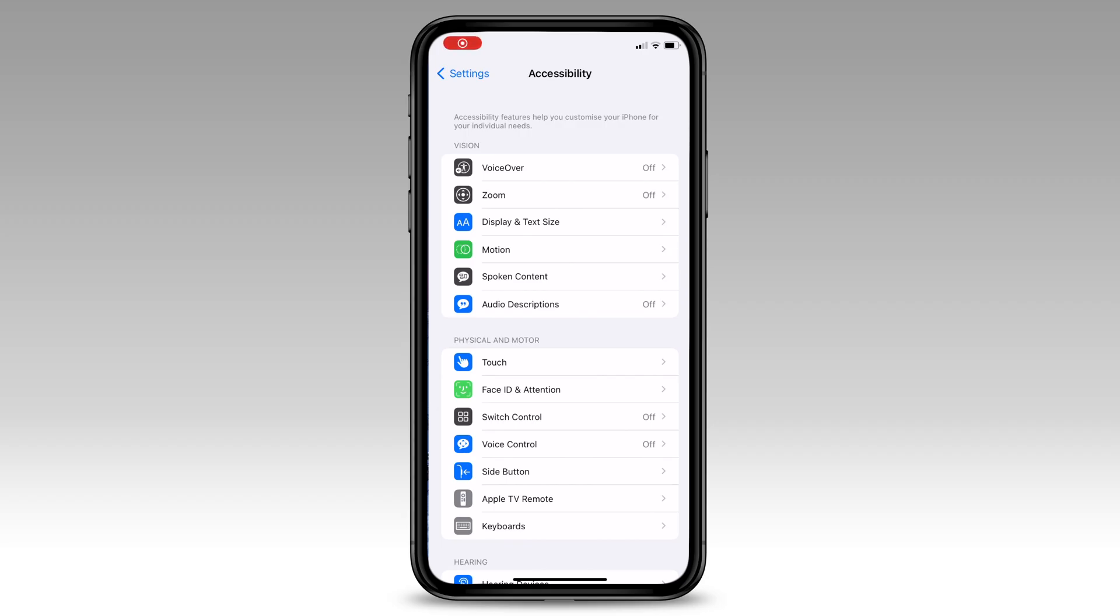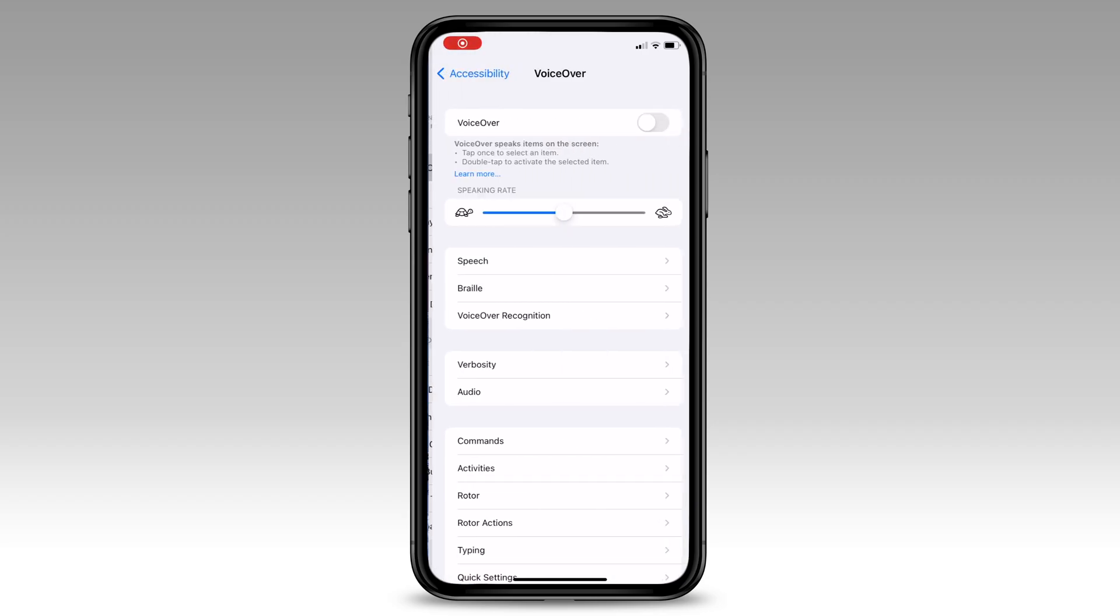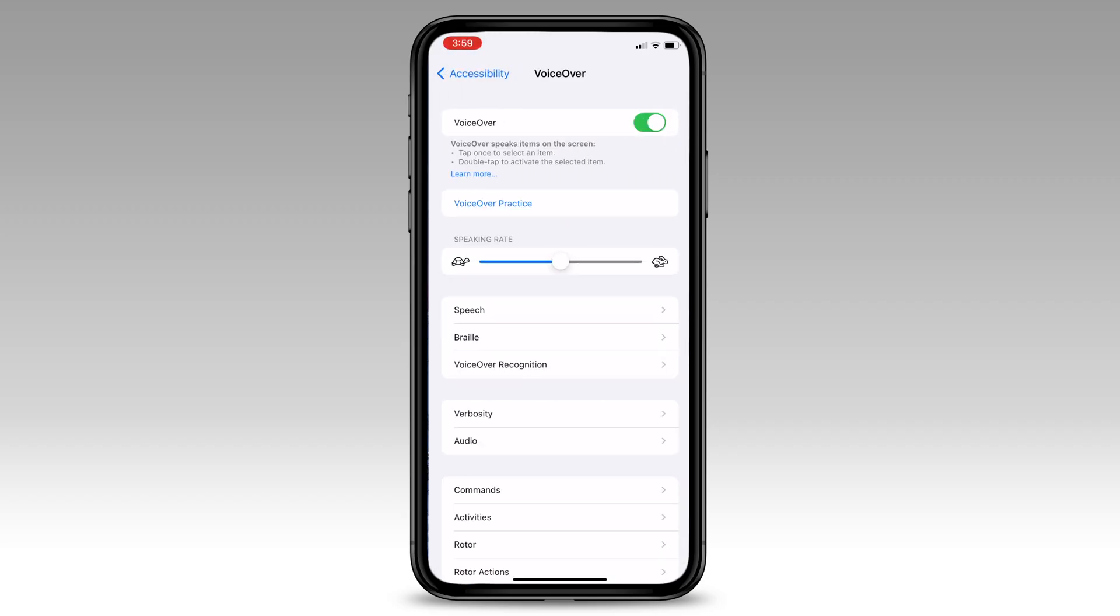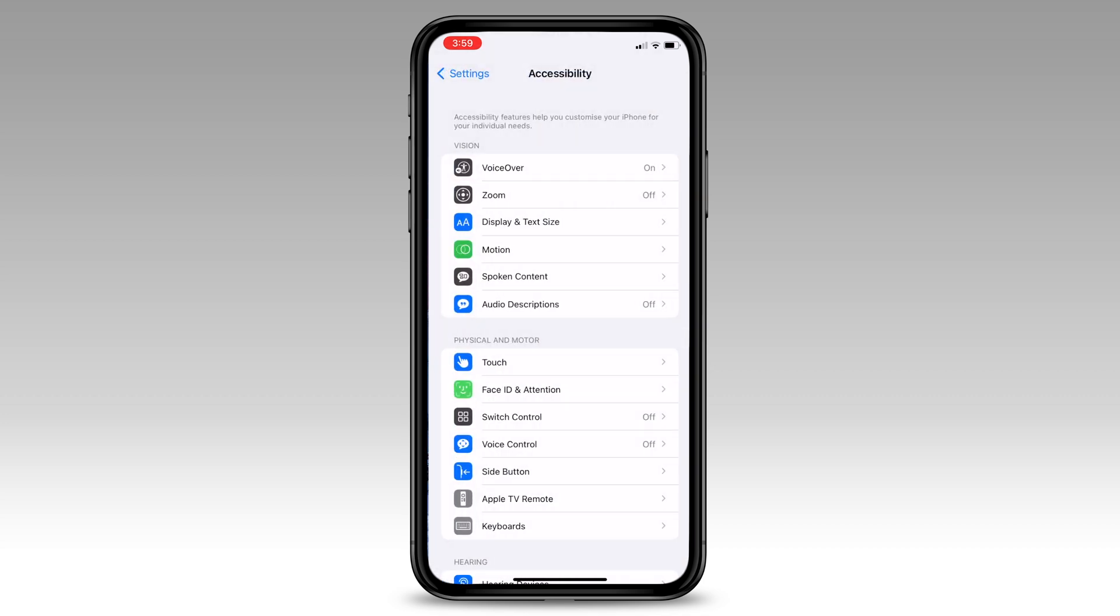Inside the accessibility settings, we want to enable the voiceover feature. The way this works is, every button or area you select will be read back to you. If you want to select the item, you need to double tap the item to select it.